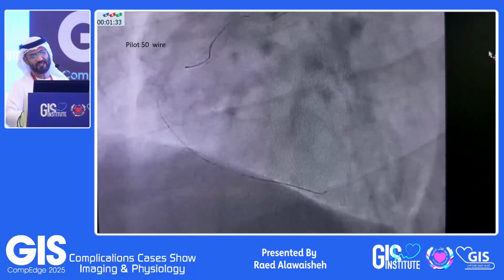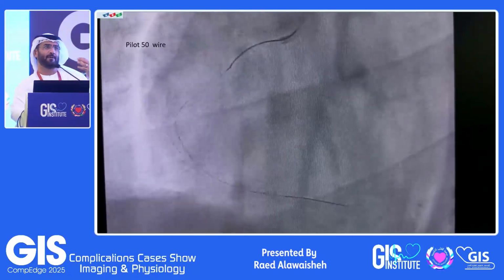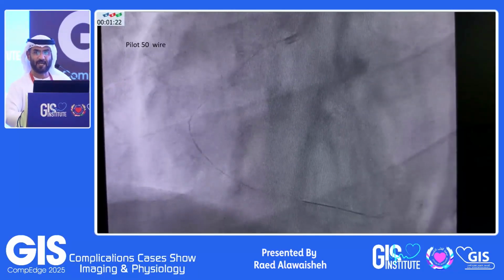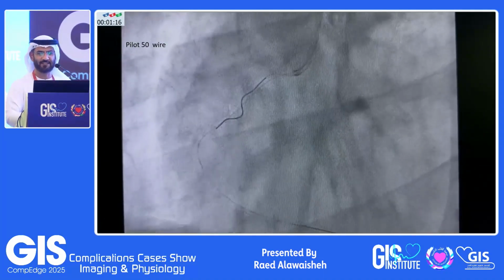So what happened after taking the next wire? He tried to negotiate hard. Again, he went back to his own target, which is to cross the lesion and to save the patient. And I think it's not bad, really. If he succeeded, he can do ballooning and he can put a graft stent.